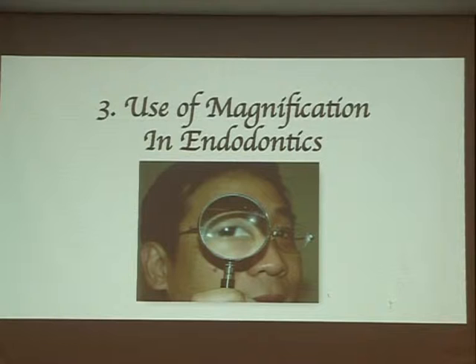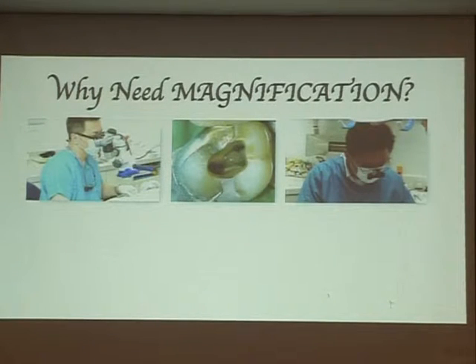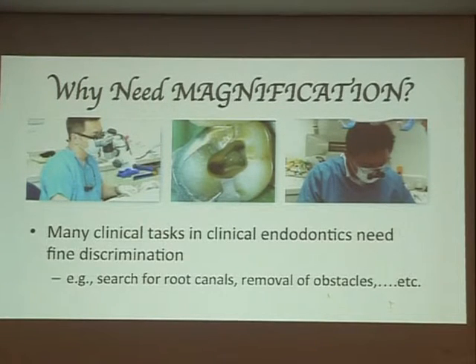The third step, I would say, is magnification. Third issue. Most people are young, okay, they're young. I'm relatively old, although I'm more senior here. So we need magnification in endo. Why do we need magnification? Very simple, we can't see.